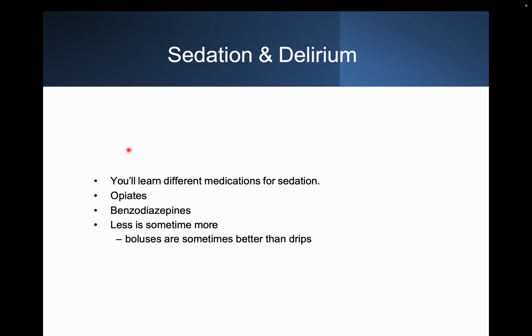If the patient has asynchrony, where the ventilator is delivering breaths and in between he is also taking breaths, there is asynchrony between the patient and the mechanical ventilator. So it is better to sedate those patients who are breathing more or whose tidal volumes are not generating properly. Put them on completely assist control mode for some time till the patient's condition recovers. So that is sedation.